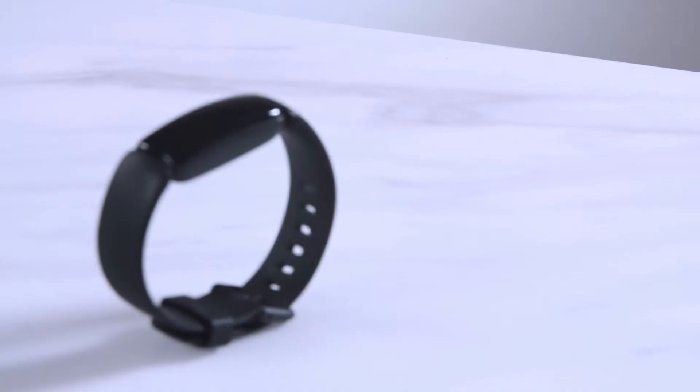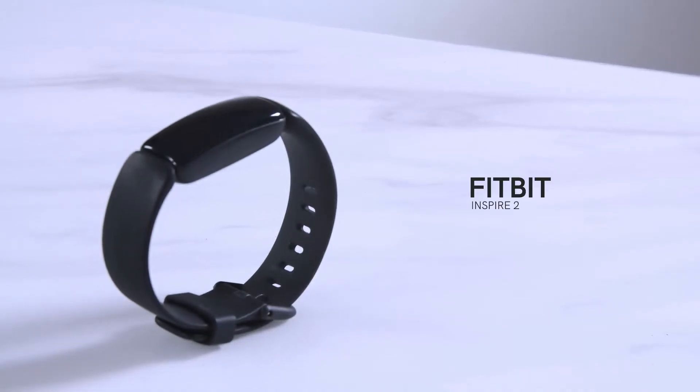Now we are ready to move to the activity tracker. You can use a Fitbit or Apple Watch as your activity tracker. If you don't already have one, TWIN will provide the Fitbit Inspire 2. TWIN supports several other Fitbit models, so if you have one you want to use, ask your coach if it is supported.